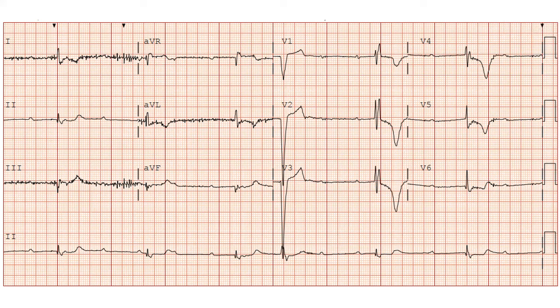May I try, sir? Yes, sir. This is a 12-lead ECG with rhythm strips taken at 10 mm per millivolt and standard speed, showing P waves at a different rate than the QRS with complete desynchrony. And the QRS shows an alternating RBBB and LBBB pattern, especially visible in V1. So I think it is advanced conduction disease with complete heart block, and I'll do temporary pacing in this kind of patient.